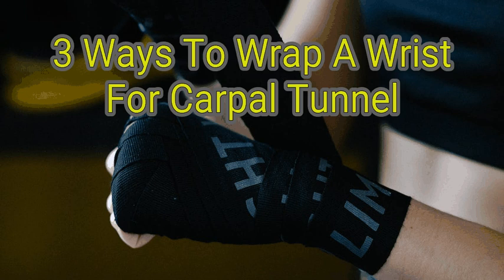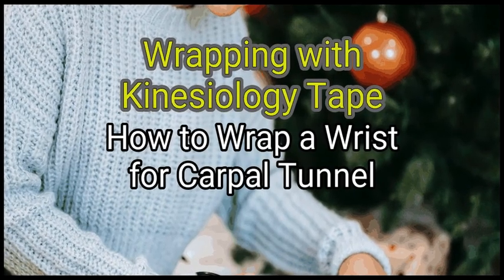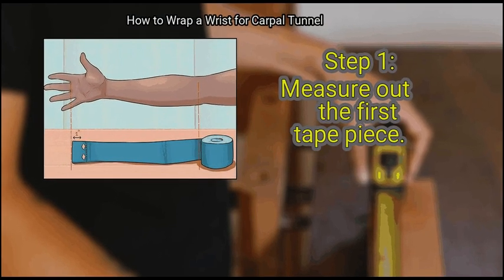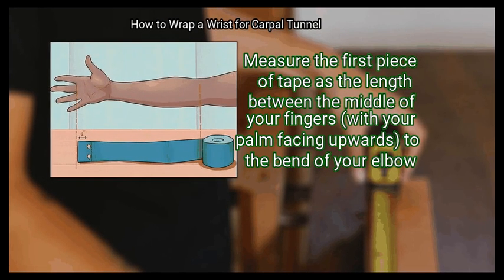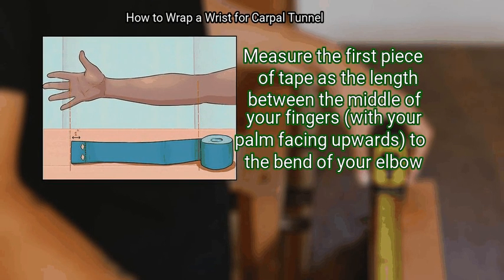So, we are going to learn how to wrap a wrist for carpal tunnel. Method 1. Wrapping with kinesiology tape. First, measure out the first tape piece. Measure the first piece of tape as the length between the middle of your fingers, with your palm facing upwards, to the bend of your elbow.